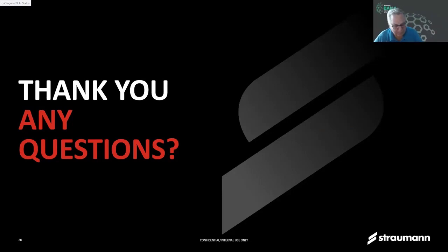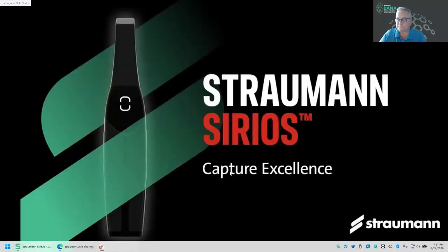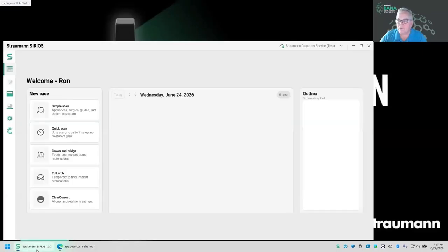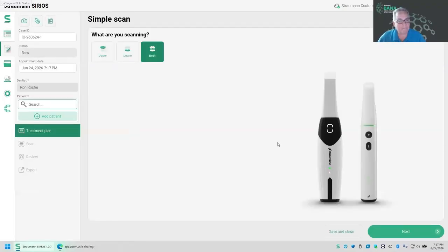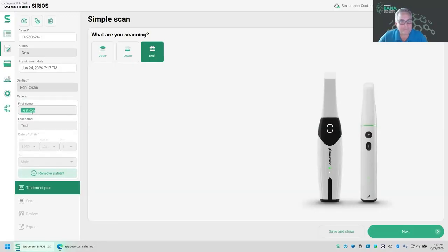So I'm going to jump out of the PowerPoint here, and I have my SIRIOS software running. I think my screen is still shared. Yes, it is. Okay, so I'm going to jump into a simple scan, both arches. I do have to put a patient name in, so I have a patient named Test Me. Okay, there we go, and we will hit next.